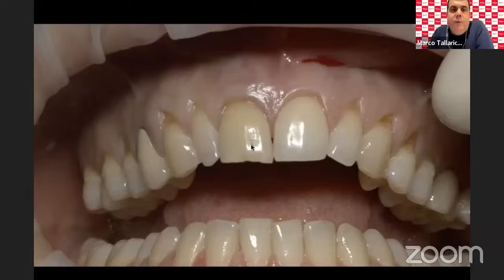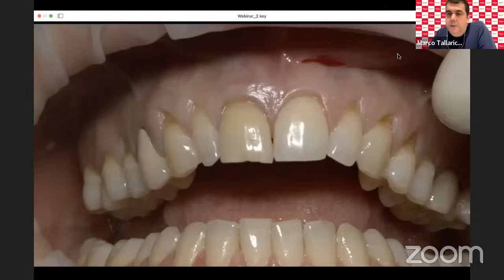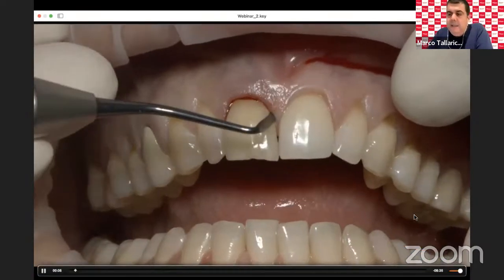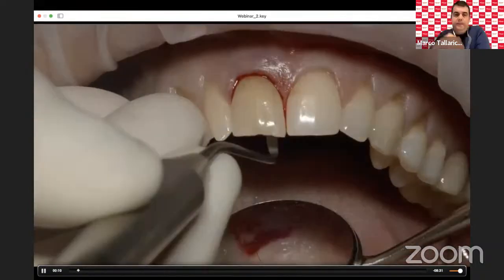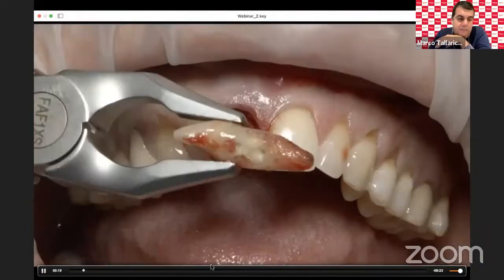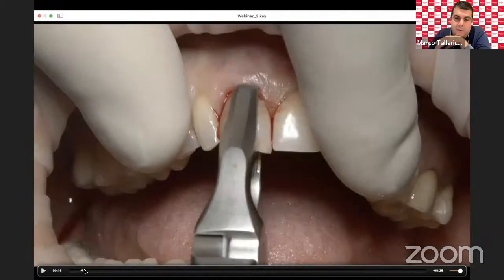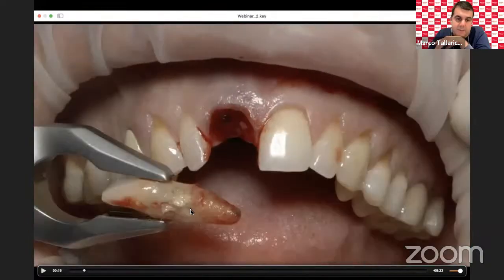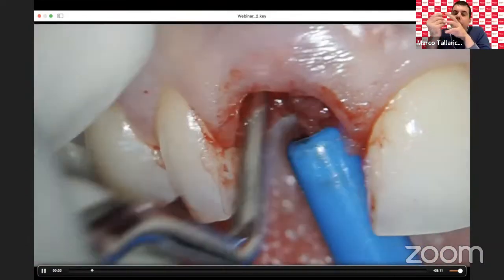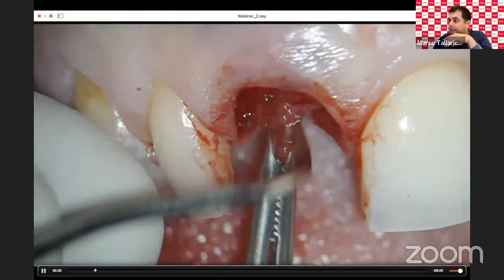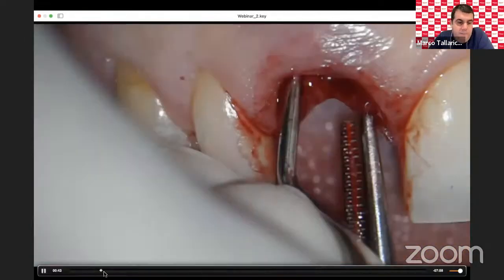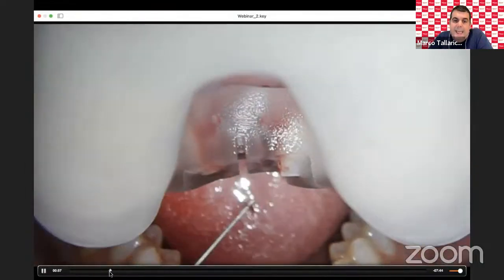I want to show the same case as a video. This is the extraction. On the plan you can see the internal resorption. Cleaning is required because there is a lot of granulation tissue. And this is the surgical guide that was used — slightly different from what I just designed. These are the inspection windows. It's very important to confirm a perfect fit — no gap between the teeth and the template.